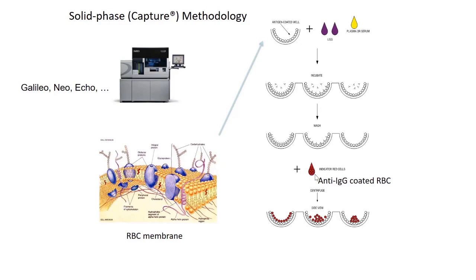If the Coombs reagent is interacting with Fcs reflecting patient-bound antibody to the reagent red cell surface, there will be a red coating illustrating the binding of the anti-human globulin. It is, again, bound to indicator red cells, and that will give your blush or your red hue to reflect the positive response.